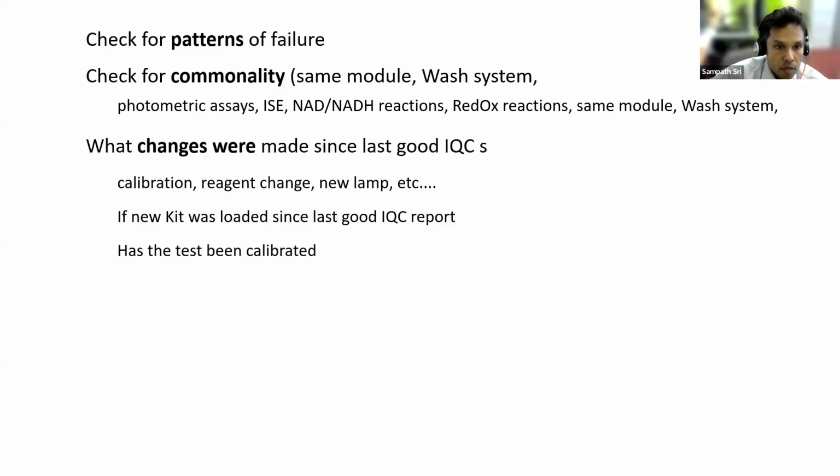Then we have to see, is there any change that we did after the last good IQC results? It may be related to calibration, reagent changes, or a new lot, or something like that. Or we may have used a new kit after the previous IQC. Or we may have done a new calibration.